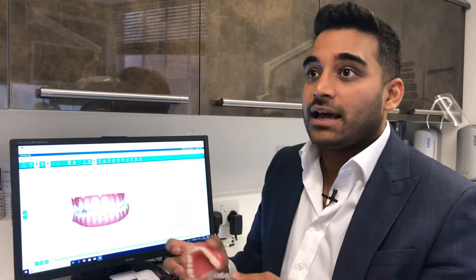Invisalign is a clear removable brace which gently applies forces onto your teeth to move them from a position that doesn't look great into perfect alignment.